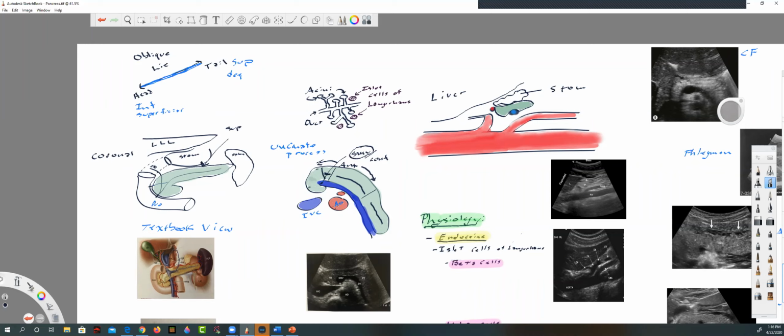The body is anterior to the aorta. And this little circle here, of course, is the SMA. The left renal vein, oh, I didn't draw that one in. If I did, it would look like this. It would come up here and squeeze, just barely squeeze through. Squeezing through right there. That little thing I just drew right there could be the left renal vein. Not necessarily all in the same exact picture, but we can see. I'll show you some of this on some of our transverse imaging. Oh, what else does it say?